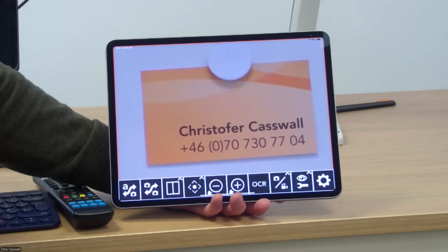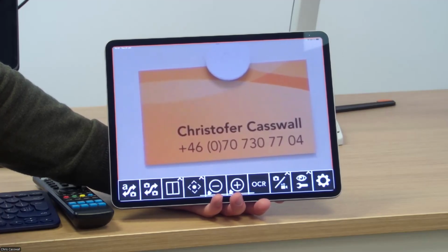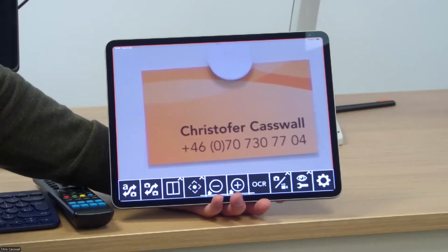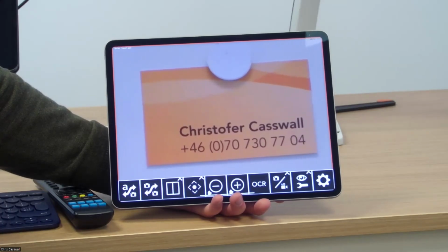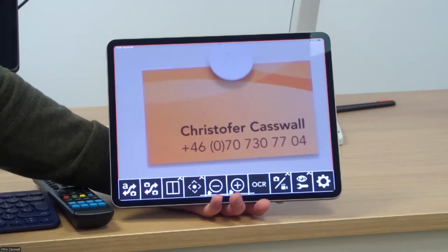We do have some successful experiments where the teacher is either drawing or taping on the whiteboard some square or rectangular areas, and then they help the student to preset those positions. Instead of being randomly anywhere on the whiteboard or the board in front, the teacher tries to be inside of those rectangles or squares just to help the student to keep up.